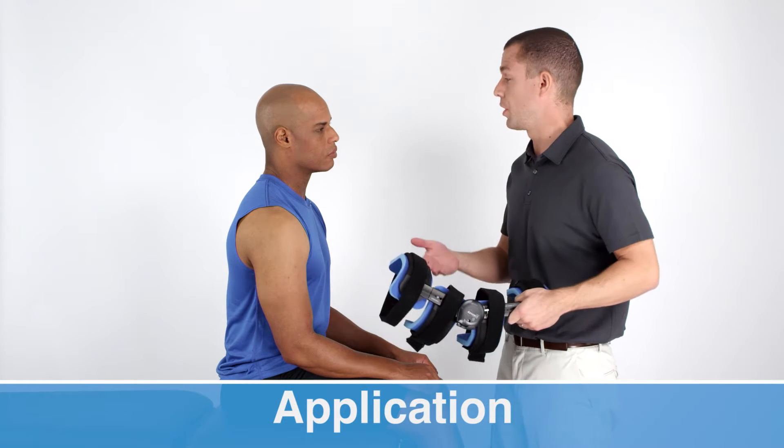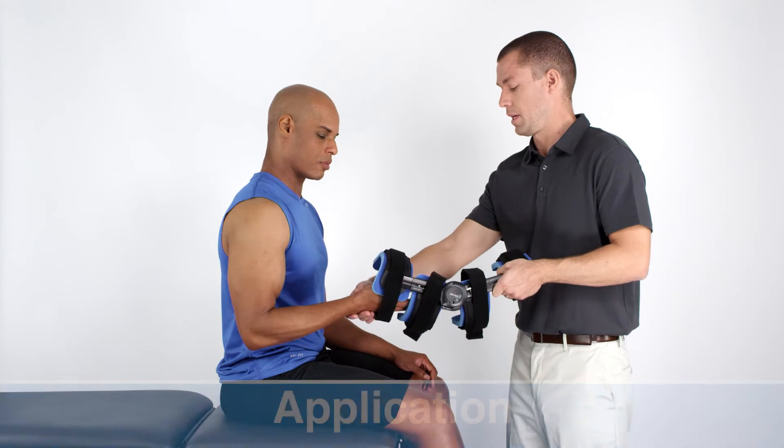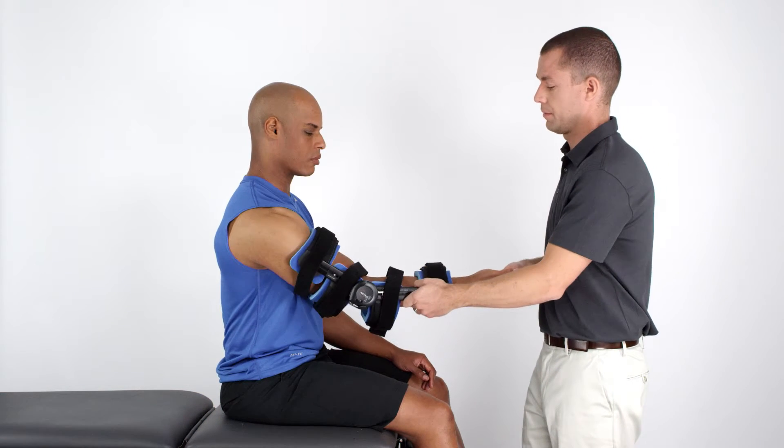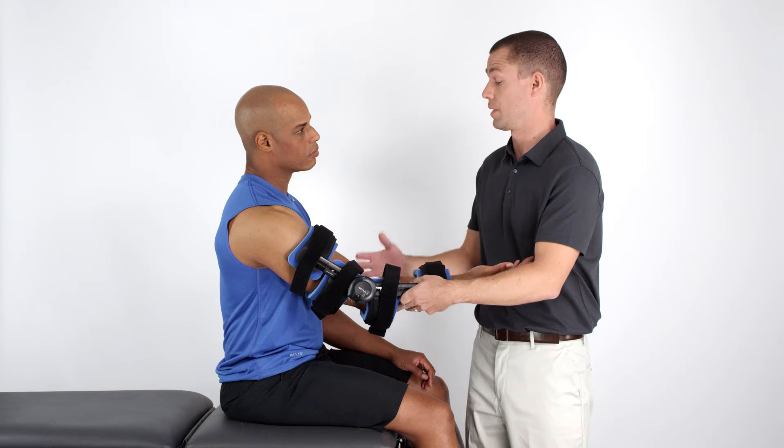With the device locked, you may apply the orthosis to the patient's arm. With the strut and the tension spring on the outside of the arm, slide the hand palm up through the molded cuffs.